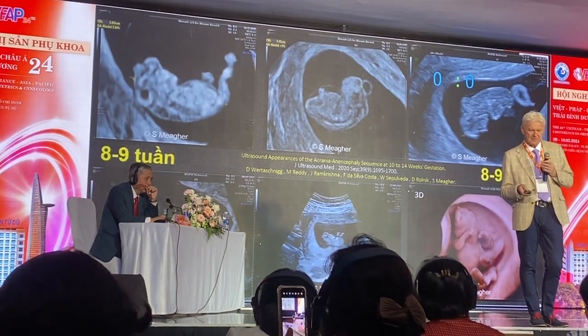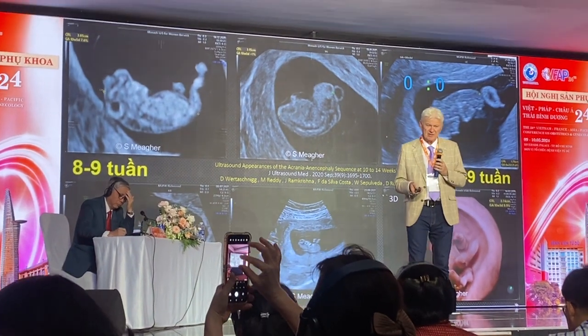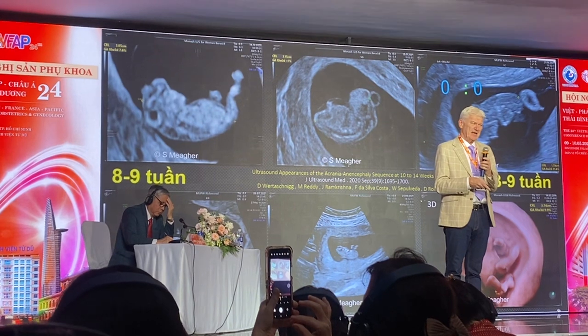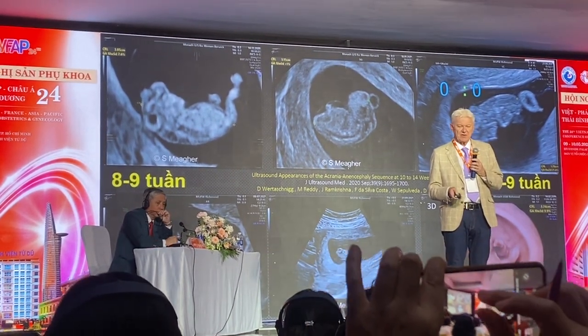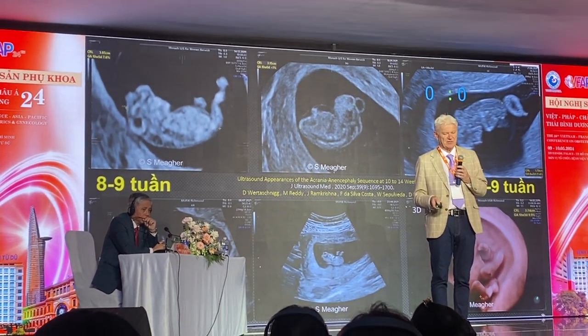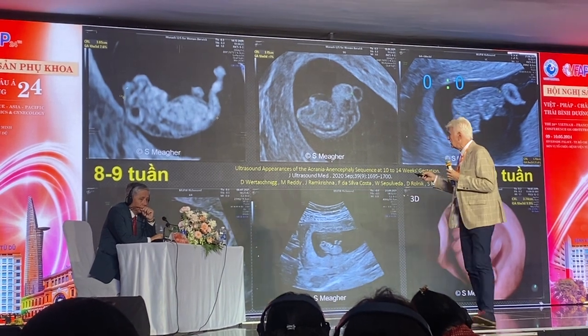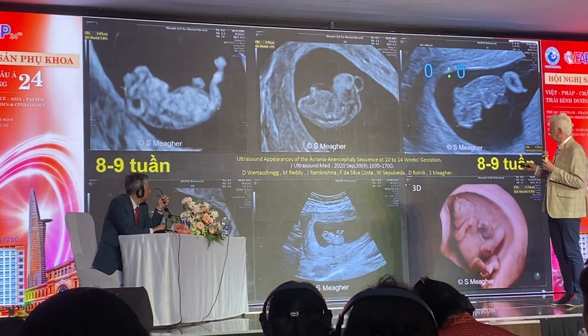But you know, we can pick acrania much earlier than 12 to 13 weeks because we do a scan before drawing blood for cell-free DNA. These are examples of acrania at 10 weeks, 9 weeks, and 8 weeks of gestation. And all of these have an abnormal appearance to the cranial end of the embryo. This one has a cystic appearance to it.